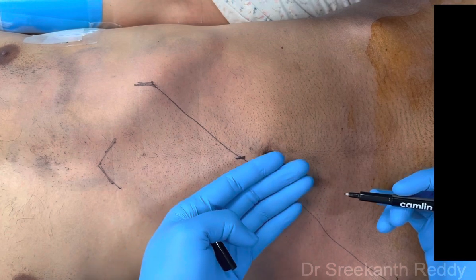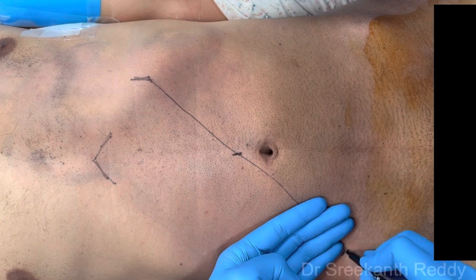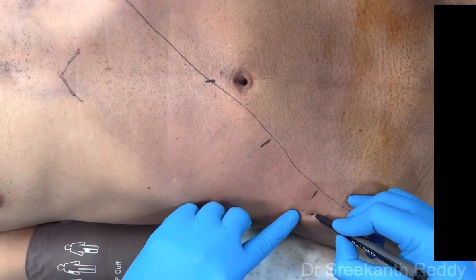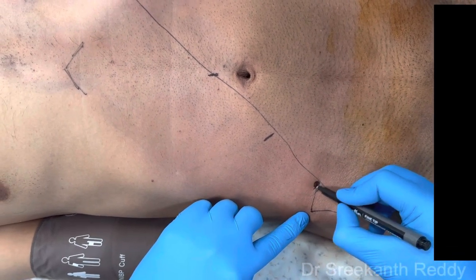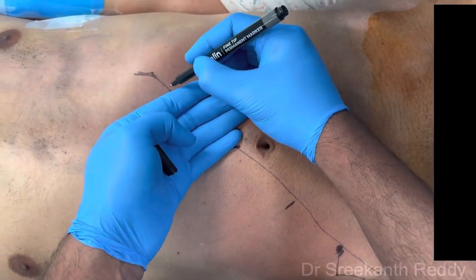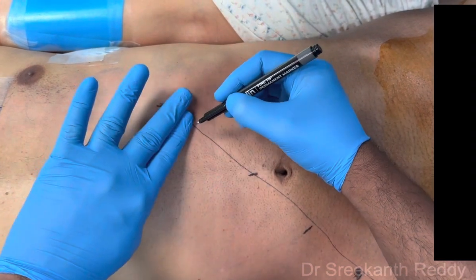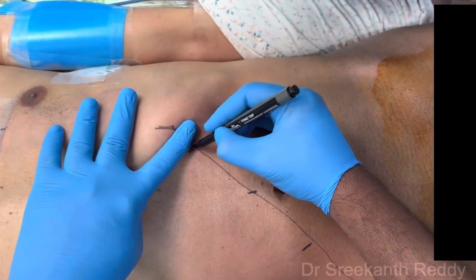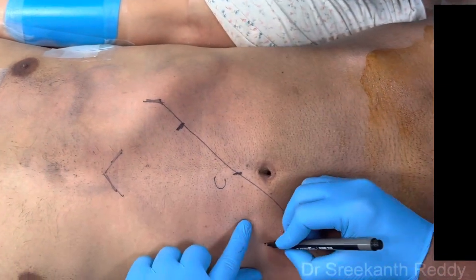The working port comes here and the second working port comes here. This port is more important — it should be 1 cm, or about 1 inch, above the ASIS and 1 inch medial to the ASIS. For the lateral-most port on the left side, give at least 4 cm or 4-finger breadth, with 1 or 2 finger breadths away from the intercostal line. So this will be the camera port, R1, R2, and R3.